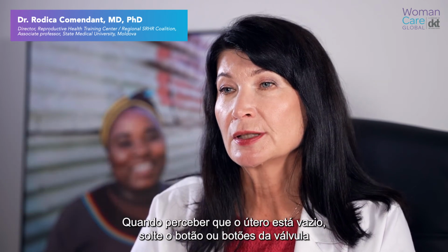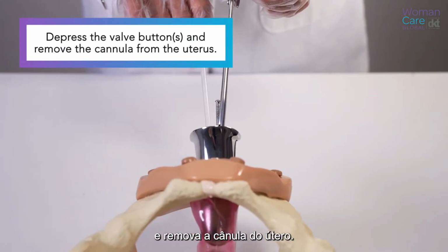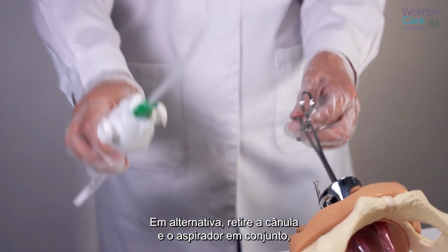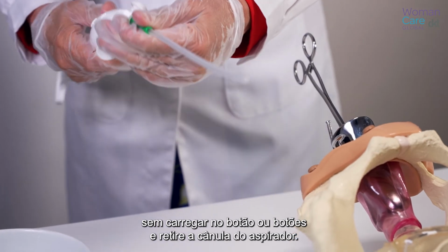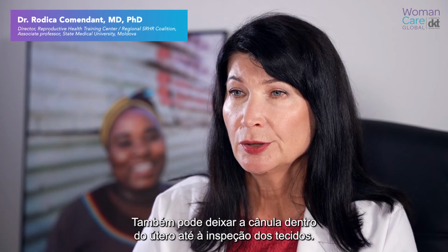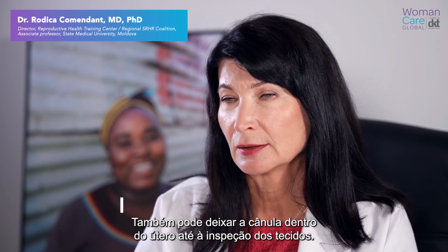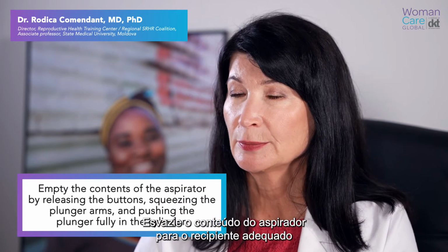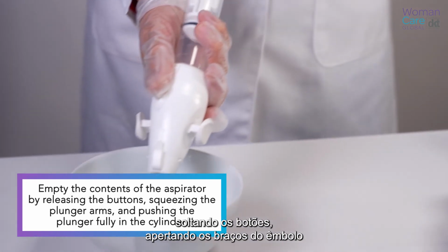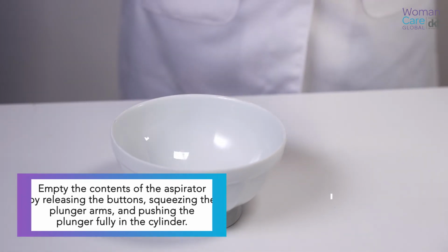When you have established that the uterus is empty, depress the valve button or buttons and remove the cannula from the uterus. Alternatively, withdraw the cannula and aspirator together without pressing the button or buttons and disconnect the cannula from the aspirator. You can also leave the cannula inside the uterus until you do the tissue inspection. Empty the content of the aspirator into the appropriate container by releasing the buttons, squeezing the plunger arms, and pushing the plunger fully in the cylinder.